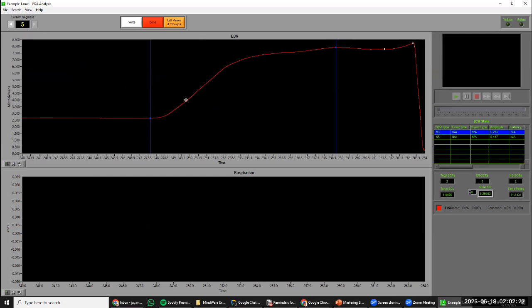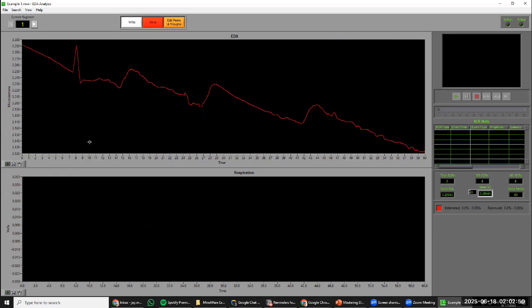Yes, we do. Later on here, we can see that they went from that area where they were around that baseline, and then we had an SCR that really changed the range, now going from 0 all the way to 8.5. So quite a bit of difference in range. And then, lo and behold, we see that normal slow rolling hill structure that we expect. That would give me the confidence to come back and say, this is fine. There's nothing wrong with it. It's just the range level.